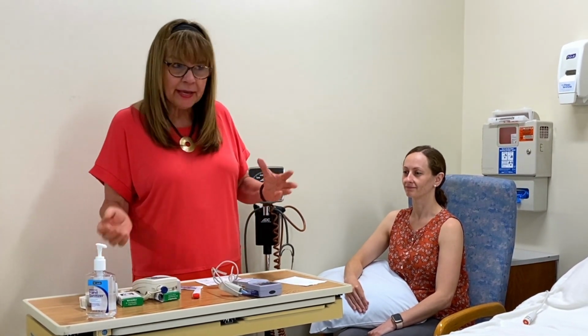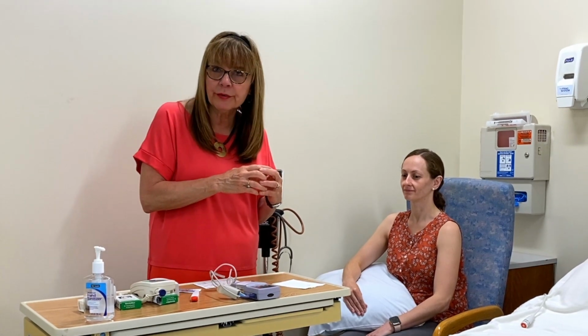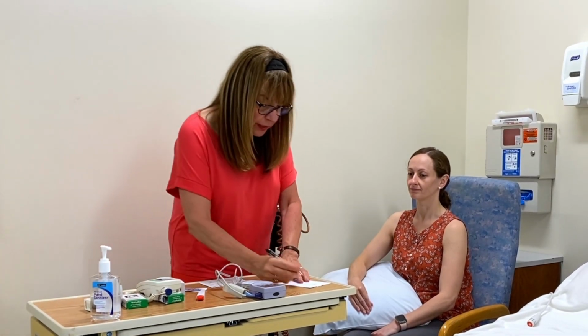And temporally, remember, we always say temporal, tympanic kind of correlates with orally as far as a norm. But we always tell students 98.6 is the normal. A degree above or below is still considered within normal boundaries. So this is normal for Monique.